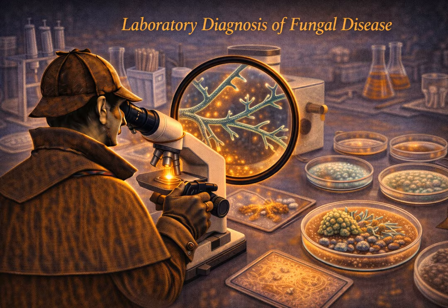And there's one classic association here that every medical student memorizes for the boards. Histoplasma capsulatum. Why histoplasma specifically? Because histoplasma is a facultative intracellular pathogen. It actively lives and replicates inside our macrophages, the very immune cells that are supposed to eat and destroy invaders. If you have a patient with disseminated histoplasmosis and you take a bone marrow aspirate or a peripheral blood smear, you stain it with Giemsa.